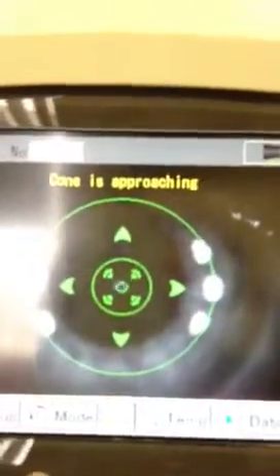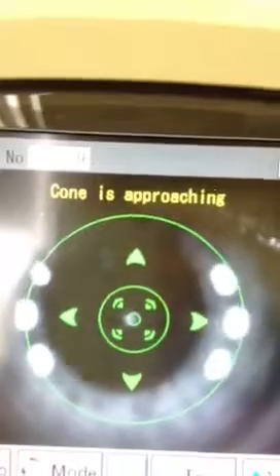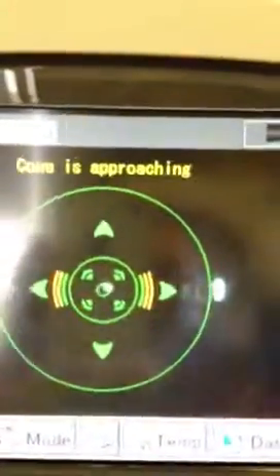Now if we want to do topography on the patient, we would go right to the cone here and hit topography right there. The cone is going to come out — it says on the screen the cone is moving. It should be fairly lined up to the patient. We would move the machine a little bit forward, grab the dot in the center, push it forward, and it would take over. As you can see, it's taking readings right now. We may have to push a little farther forward — there we go. That's it. Here is the data.